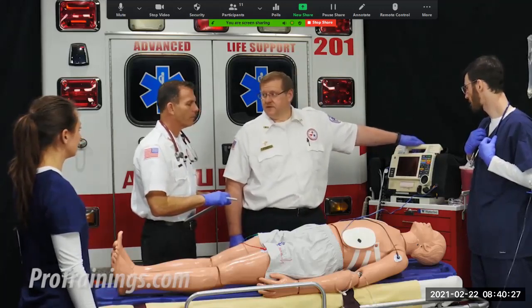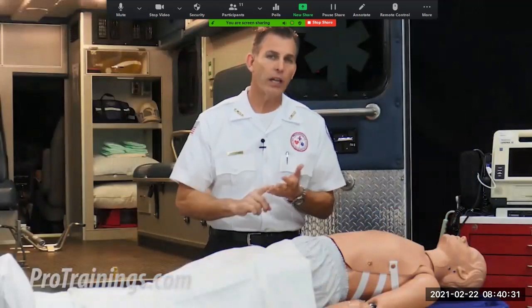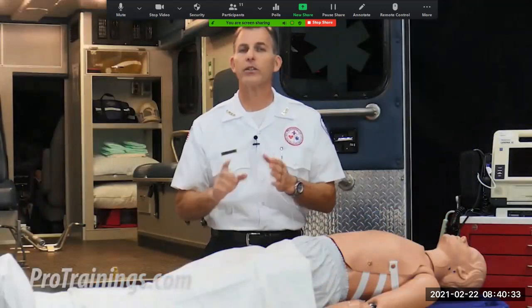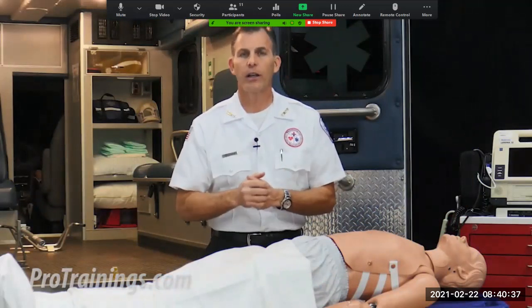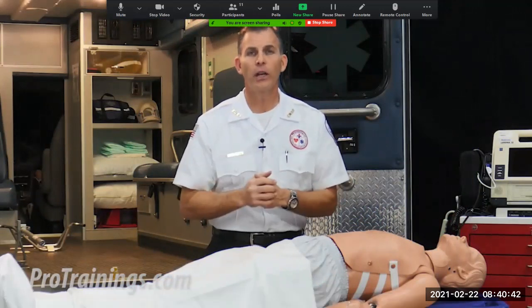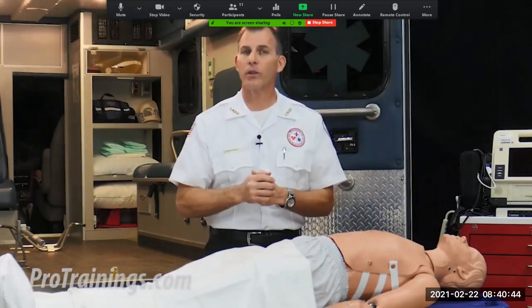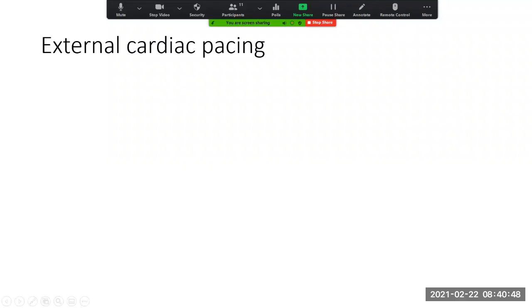Once the patient's perfusion has improved, we need to continue to monitor the patient. We need to work on improving perfusion by trying to determine the cause of the bradycardia and treating it accordingly. Now keep in mind, transcutaneous pacing can be uncomfortable, so pain management may be something to consider while deciding to move them to the next step.